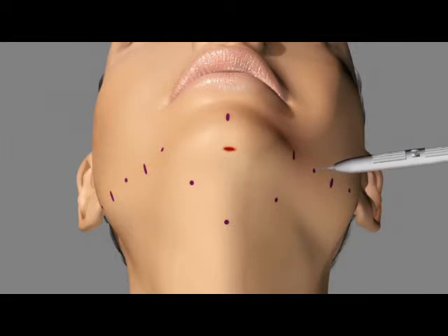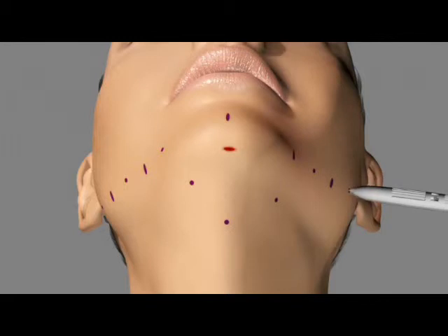These are the anchor puncture sites on the lateral ramus, where the suture will be weaved around the ligamentous attachments. The area underneath the jawline, these are called pivot points that allow the pivoting of the rod as it travels around the curved surface of the jawline underneath the mandible.